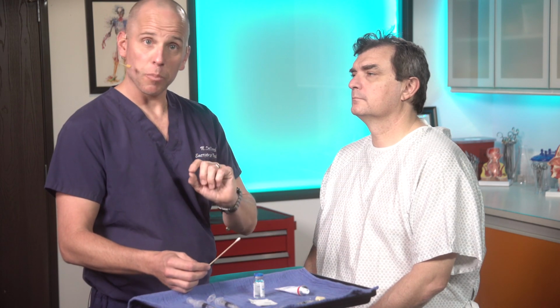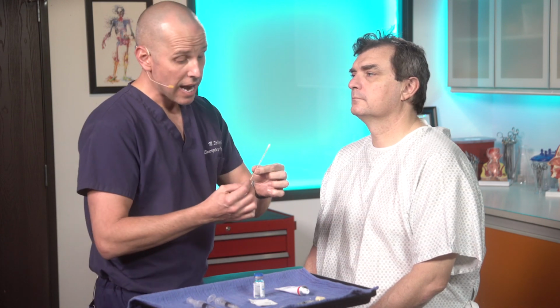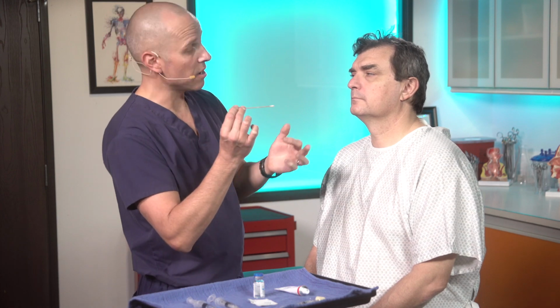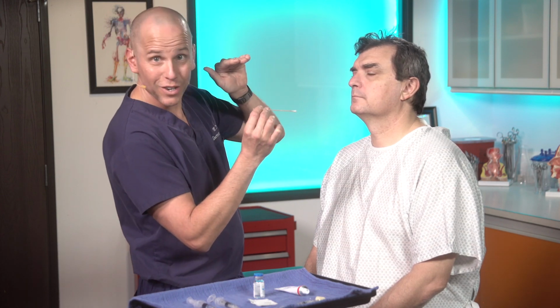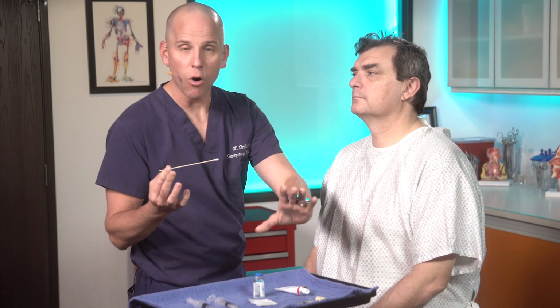So what I'll do is I'll take that 4% viscous lidocaine. I've applied it to the tip of my cotton tip applicator, and now I'm going to introduce this into the nare. In the same way I would for packing, you want to go horizontal on the medial aspect, avoiding the turbinates that are on the lateral aspect, and you don't have to rush this. You're just going smooth, slowly, patient comfort. Eventually, a lot of patients, if this works well for them, I will teach them how to do it, and then they can go home with a cotton tip applicator and some lidocaine, and they can take care of their migraines themselves if they're comfortable placing this in their nose.